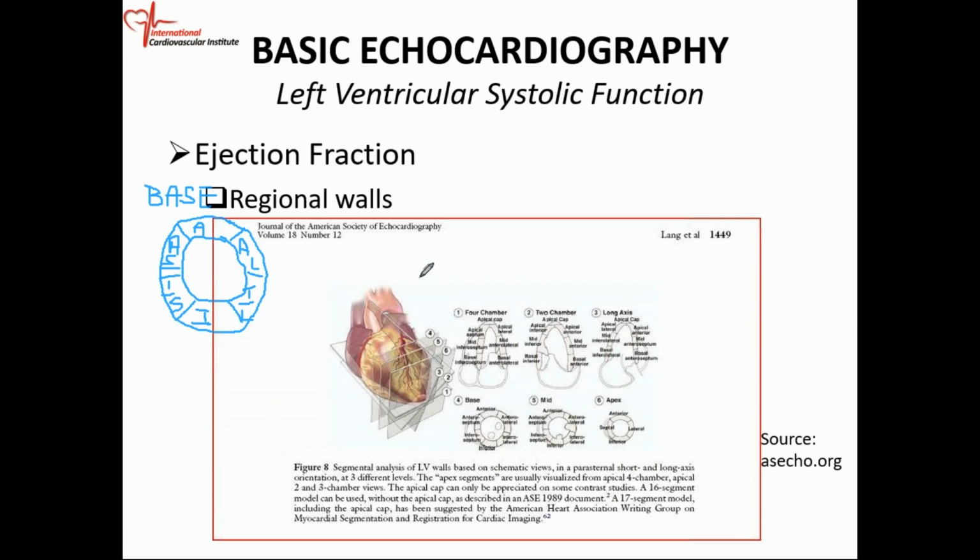Now remember, you're bread loafing the heart, the base is right up here. Further down, you're going to get the mid segment, and the mid segment is where you have your papillary muscles. You remember that. We're just cutting the heart like a loaf of bread, and we need to look at the different segments. So we can put the muscle there, two papillary muscles. And at the base you have the mitral valve. Some literature or material will put the mitral valve like that. So this is at the mid segment.